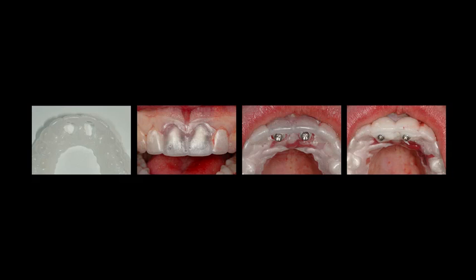So basically we have this shell that we made from a model that we happen to have, fortunately, before the accident for this patient. And then the holes are in the palatal so that I can seat the shell over top of the implant abutments and then get at these screws and unscrew the implant abutments. And then when we put the final provisionals in, we basically use shorter screws at that point, obviously, so the screws aren't sticking out that far.